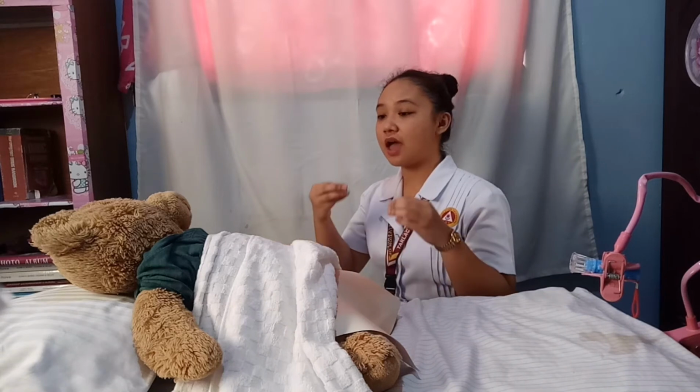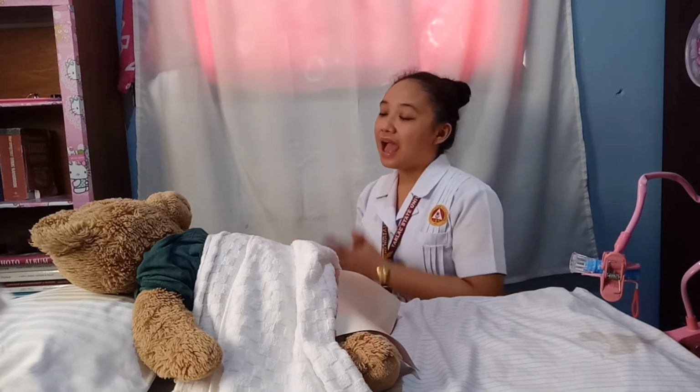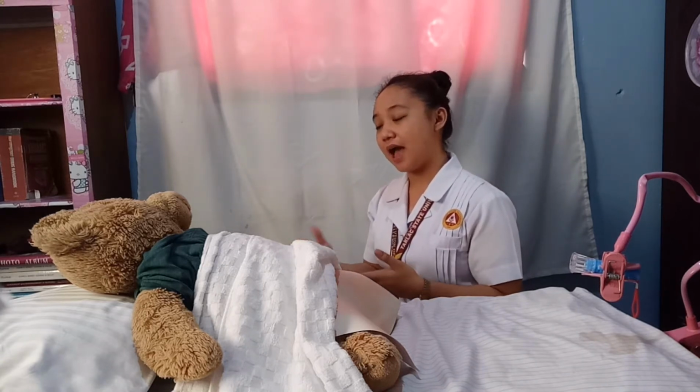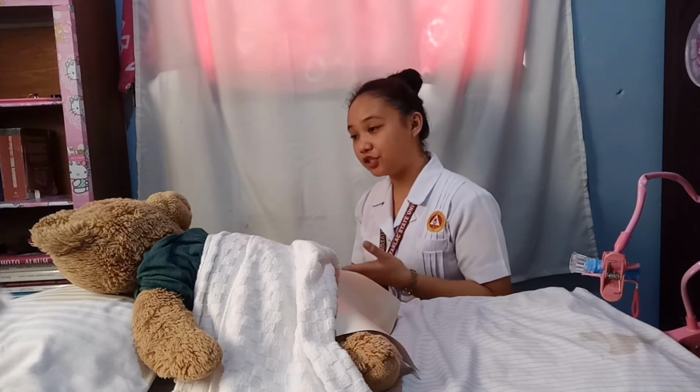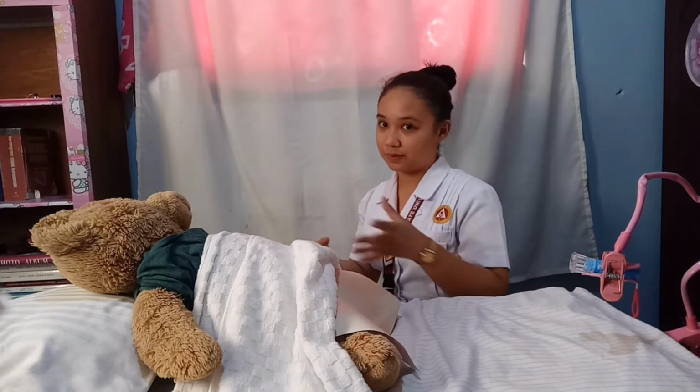We also need to ask our patient if they have an allergy, especially to iodine or latex. So, hi sir, or hi ma'am, I'm Rochelle Devera, your nurse for today. May I know your full name? Do you have any allergy, especially to iodine or latex? Then after that, you need to explain everything to your patient.